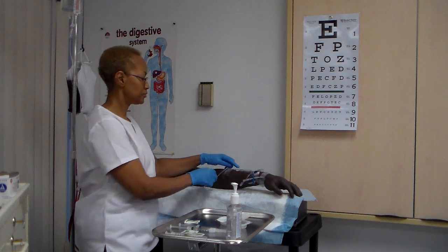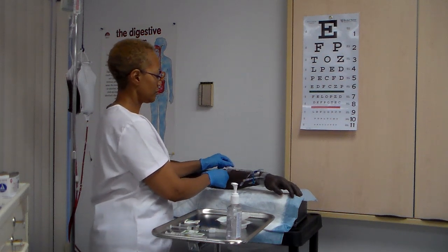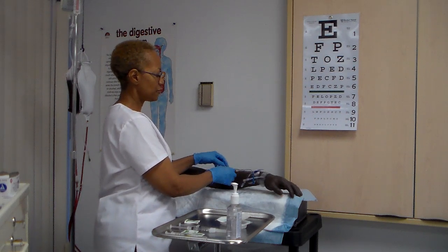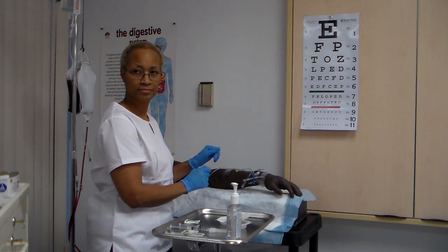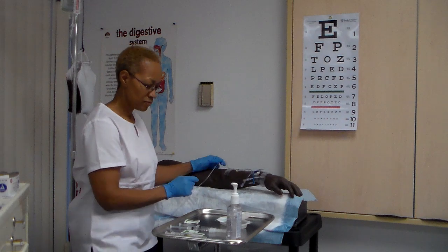Release tubing and inject medication within amount of time recommended by institutional policy, pharmacist, or medication reference manual. Okay, I'm going to release the tubing, then I'm going to inject my medication. All right. Use watch to time administration. Intravenous line is sometimes pinched while pushing medication and released when not pushing medication.